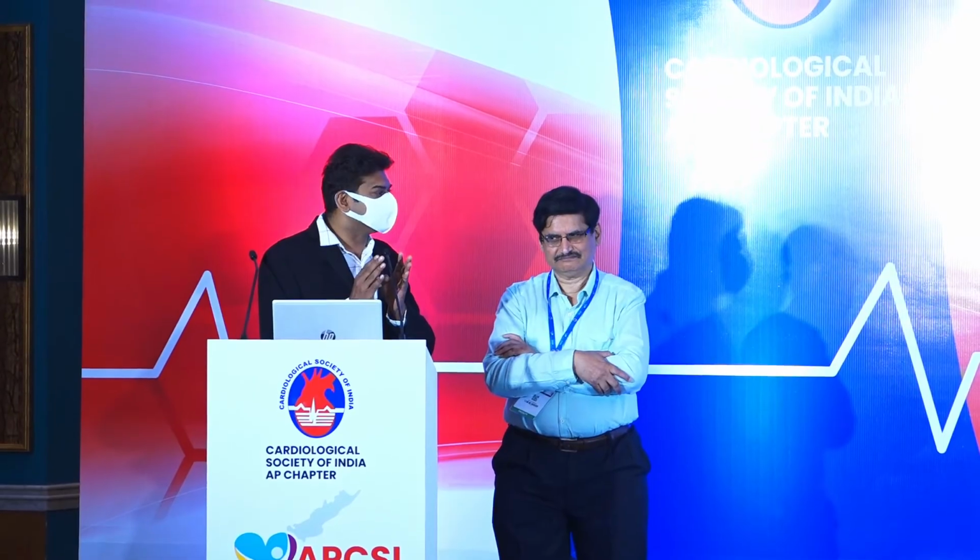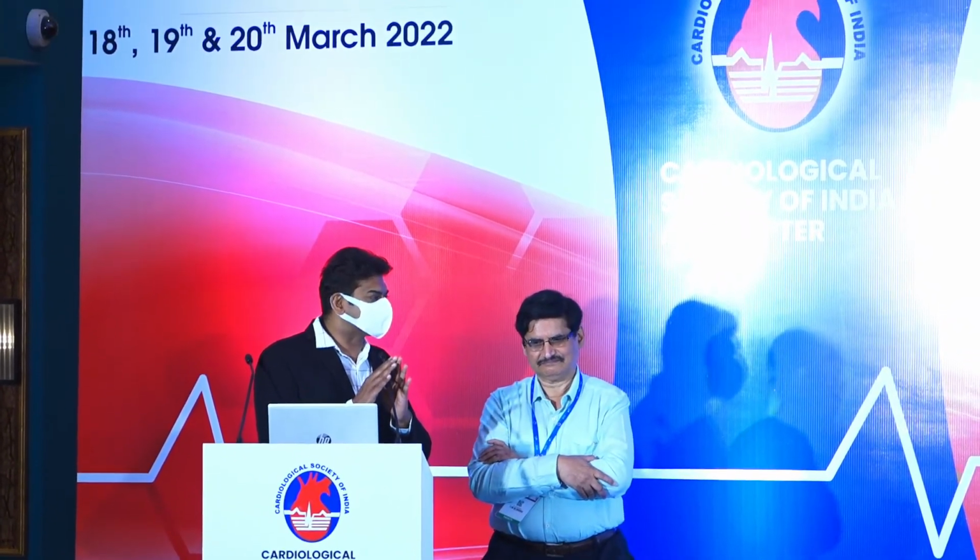So combining IVUS and OCT in this kind of situation will give you an advantage, but I don't know the logistics of how it would be here. But at present a lot of people are affording this imaging if you explain it to them well. So combining IVUS with OCT would be one more thing rather than fighting against each other, combining both in particular situations.